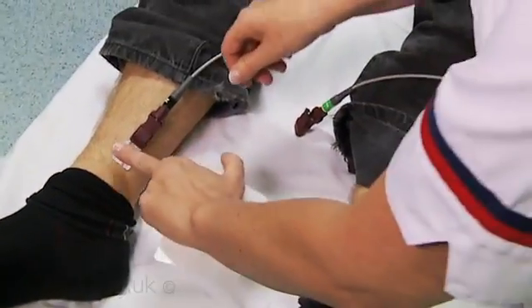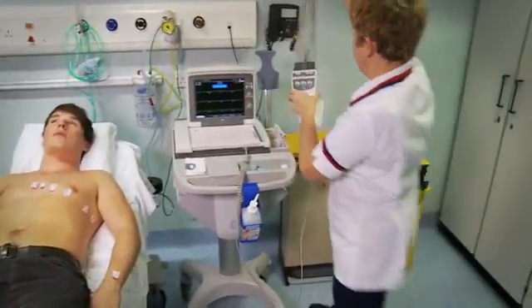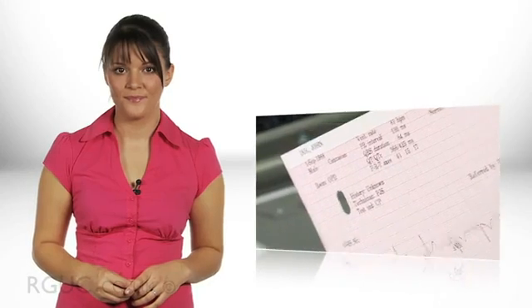Now the procedure is complete, allow the patient to redress. Clean and clear away equipment, storing it appropriately. Remove your gloves and apron if worn and clean your hands. Finally, document on the ECG trace as required. The patient details, along with the time and date of recording, may have automatically been printed depending on the ECG machine's settings. If not, add this now. Also make a note of any change to the position of the leads, the position of the patient, or to the settings. Document the procedure in the patient's notes and inform relevant personnel that the test has been completed so that the results can be analysed.